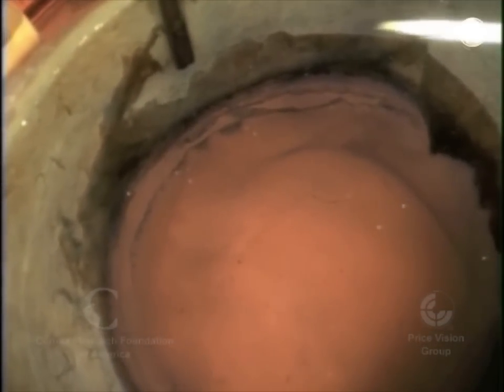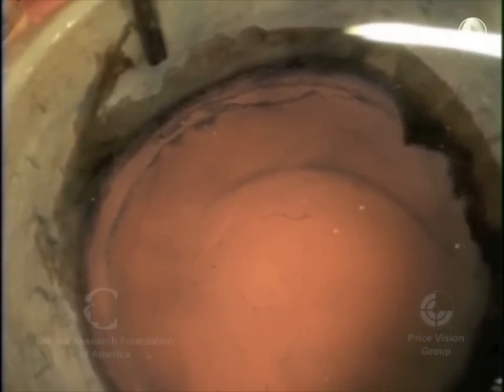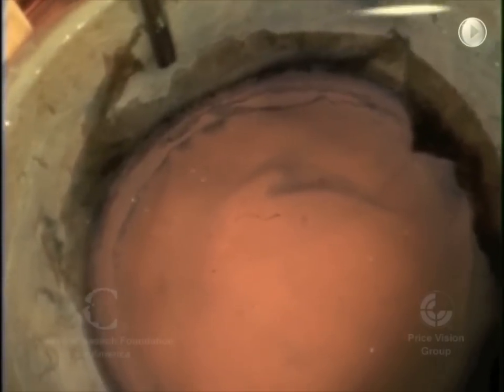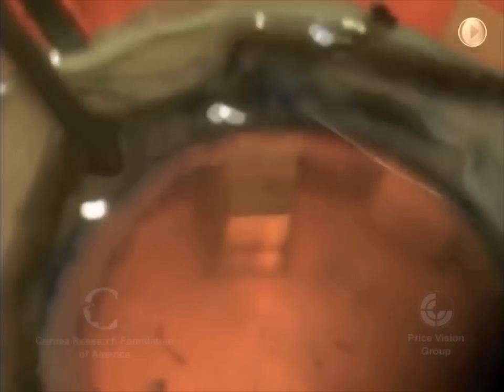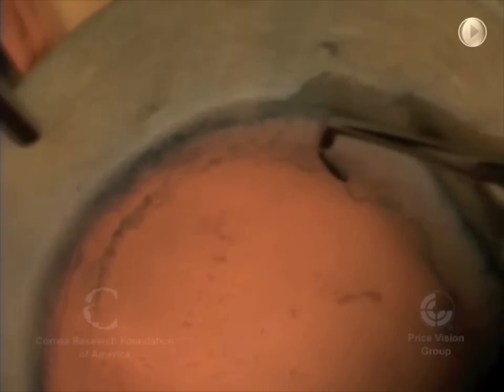Then we're going to stain it with a special blue dye — trypan blue or vision blue — and remove the outer area peripheral to the scoring. Then we're going to go around and elevate up the edge of Descemet's membrane just inside the area that we scored. It's very important to do this all the way around, 360 degrees, and make sure that there are no loose tears.